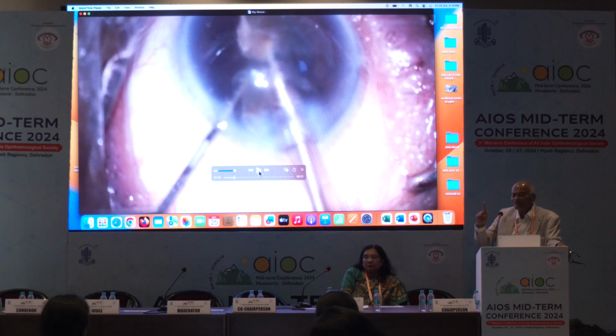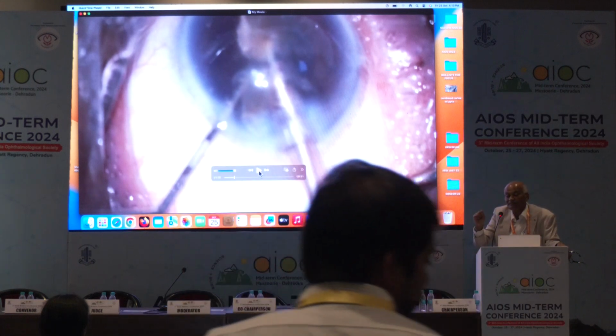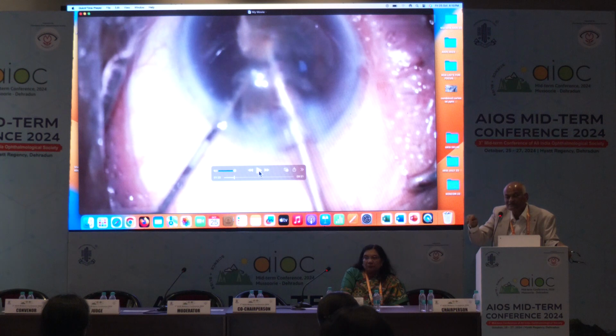And why? It is not for any soft cataract. Remember, it is for the hypermature cataract and for the nuclear cataract. In these cataracts, if your speed is not reduced, a surge is going to happen. Why? Because it is a nuclear cataract, no epinucleus, no buttress, and your motor speed is 120.